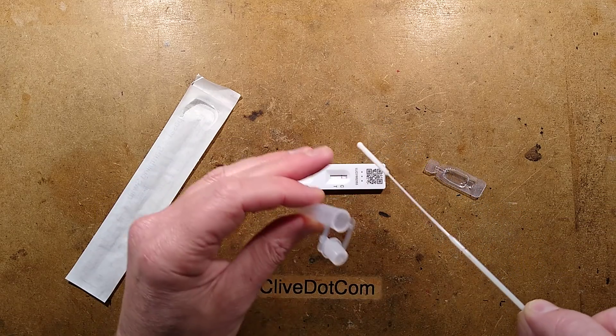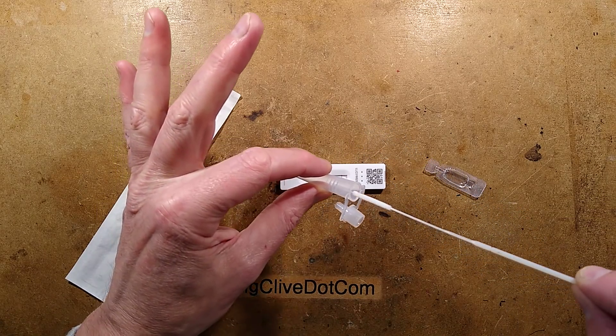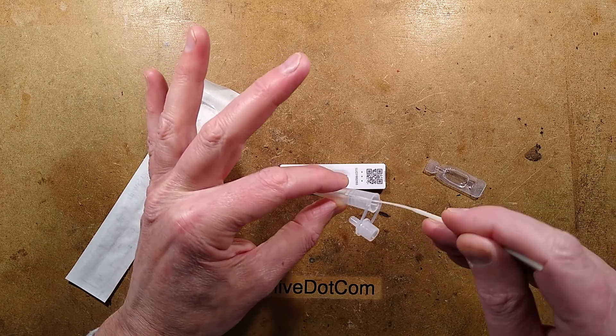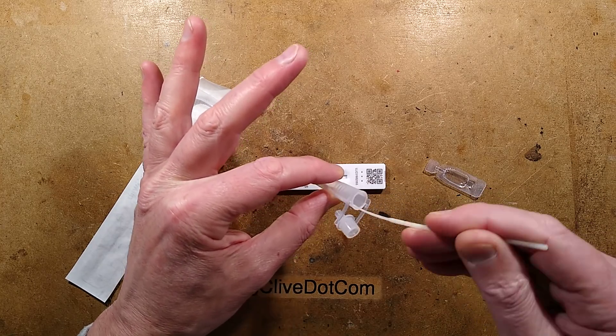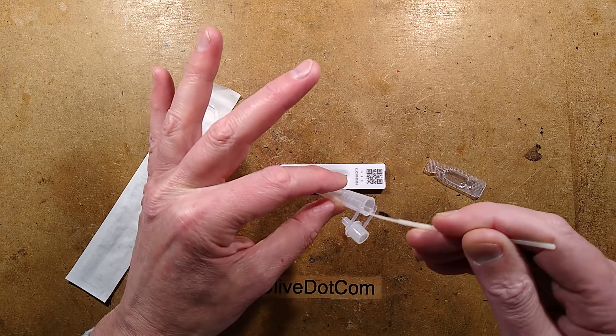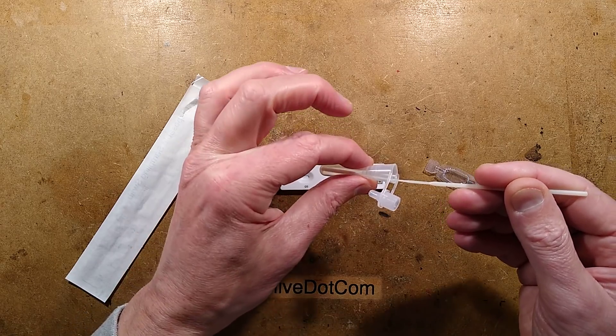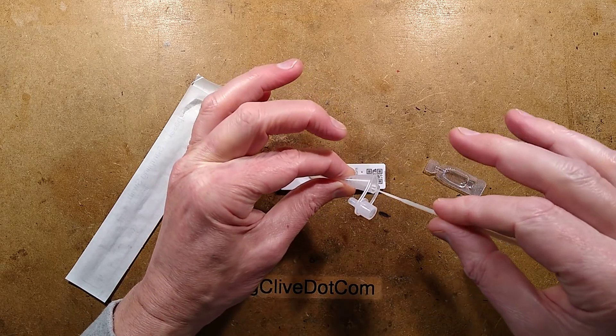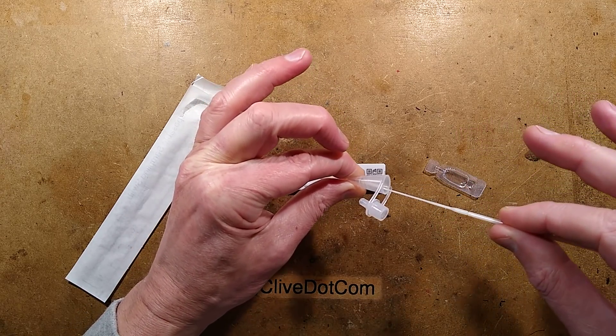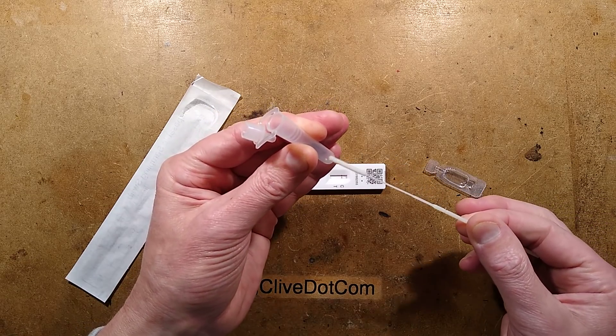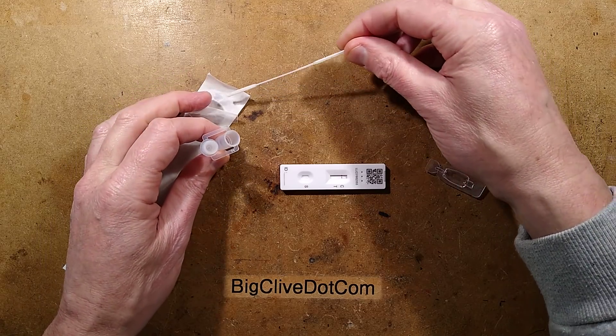Once you've got your sample, you place it into that liquid and you press it around to really mix it in. And then once you've done that for about 15 seconds, you squeeze this little plastic tube and then you drag it out so it squeezes it off the pad and you end up with as much of a concentrated dose in there as possible.